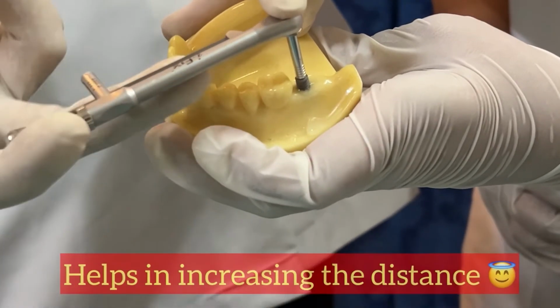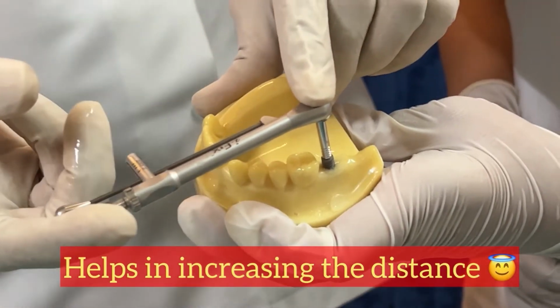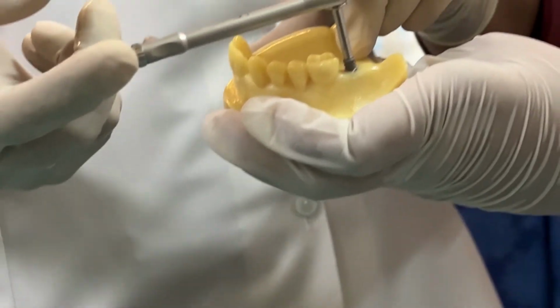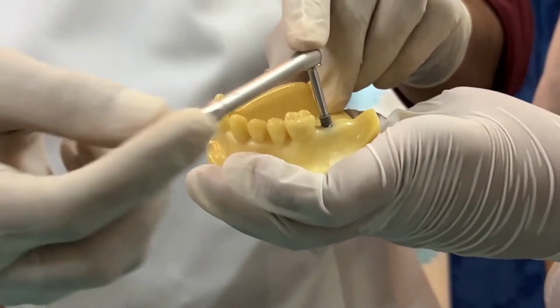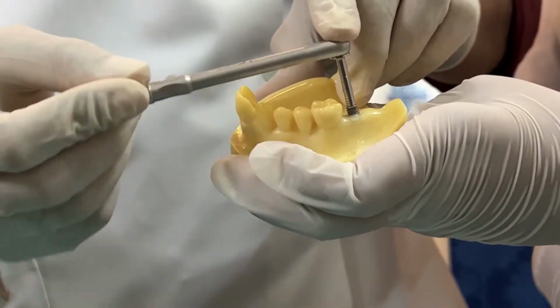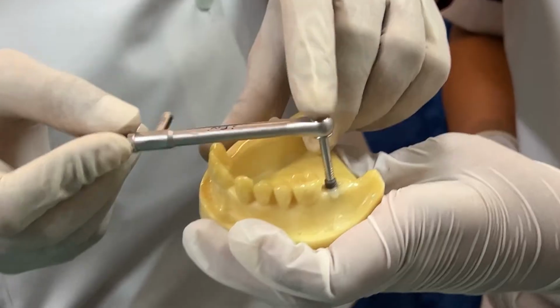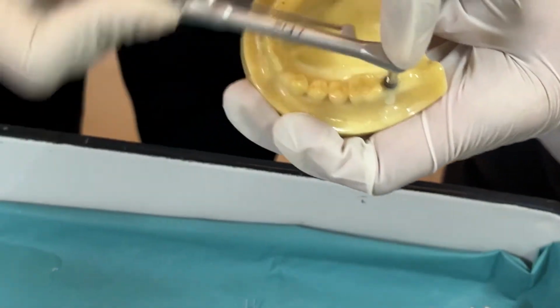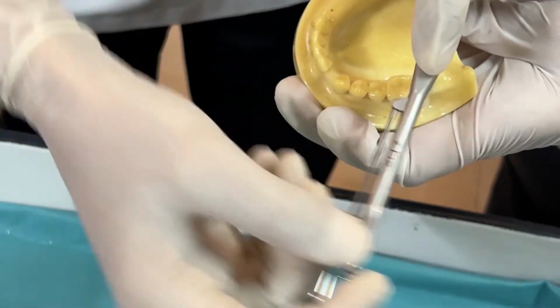So now can you see this distance has increased. So in the patient's mouth, otherwise the lip, teeth, etc. would have started hitting. Now you will be able to rotate it easily. So now take your time. Here I am just rushing it up, but in the patient's mouth you don't have to take it like a race. So now we are taking it inside, and this has to take its own sweet time.